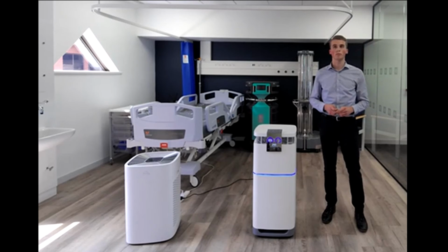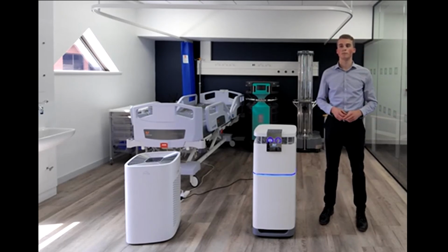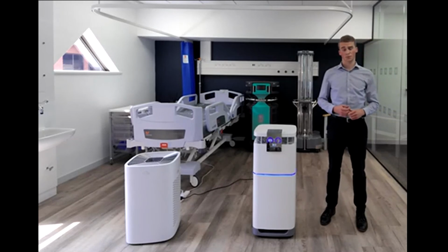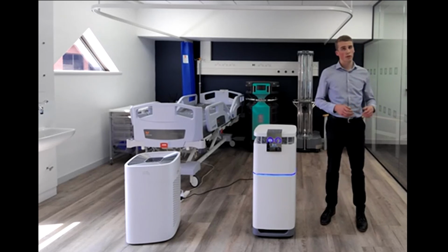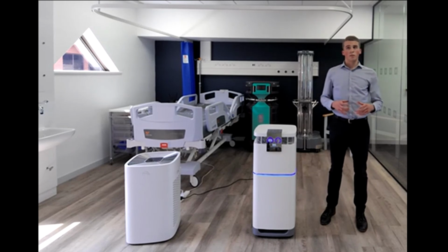Great, thank you. Another one that's come through is, how do you ensure that the contaminant in the filters doesn't escape back into the environment when changing the filters? Yeah, that's another really good question, and one that you do need to be aware of. Once the systems have been used, it doesn't take long in a hospital environment, a busy hospital ward for example, for there to be a lot of contaminant in the air if there's a lack of mechanical ventilation. And what needs to be done is to take care.